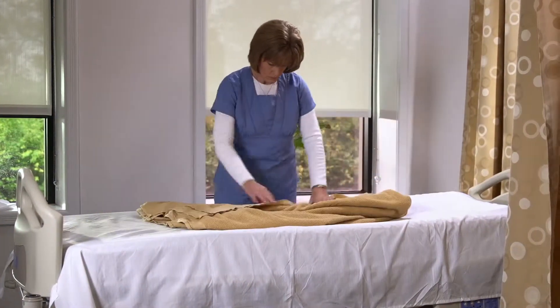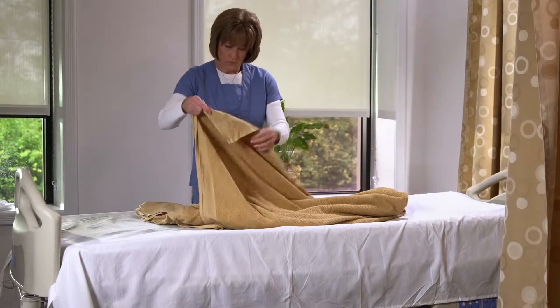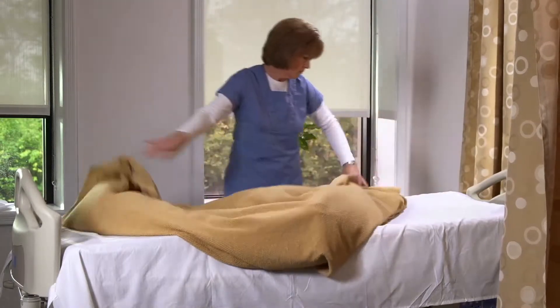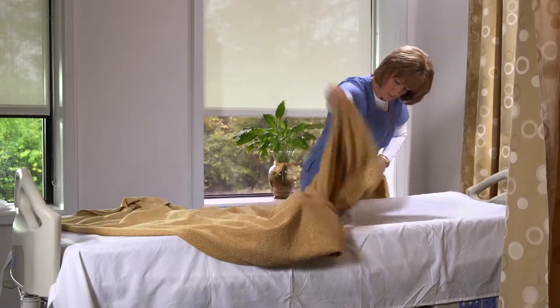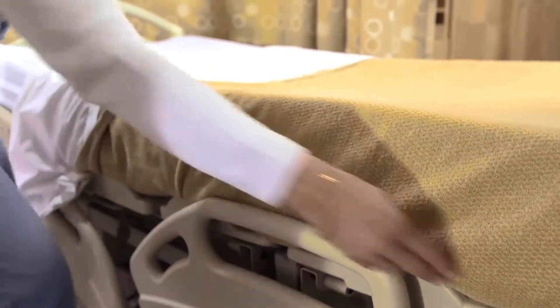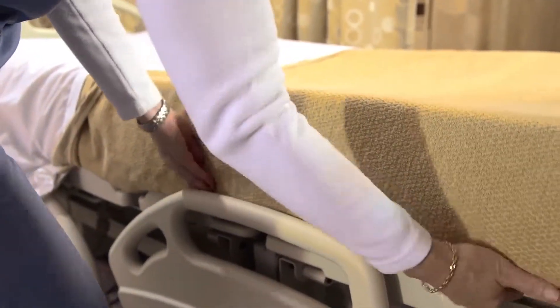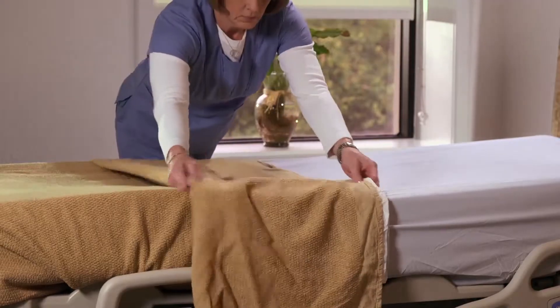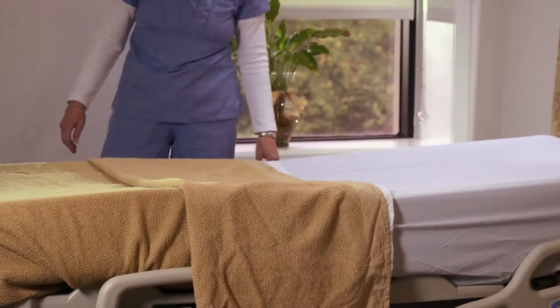However, the weight of the bedspread may sometimes pull the lighter weight flat sheet off the bed and possibly onto the floor. To reduce that possibility, tuck the bedspread under the mattress further towards the head of the bed, particularly the side that is not being used for entering or exiting the bed. As you are making your hourly rounds, check the surroundings in the patient's room to secure, rearrange, or replace the linen.